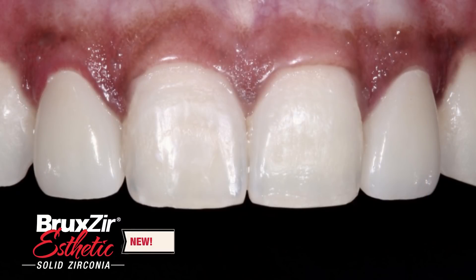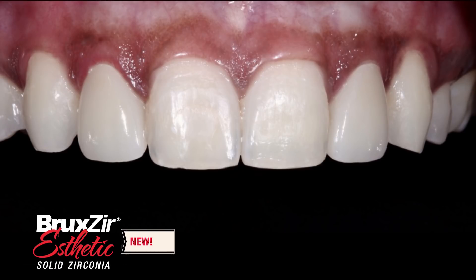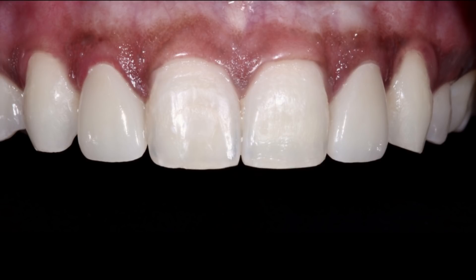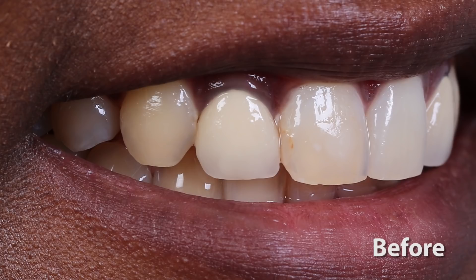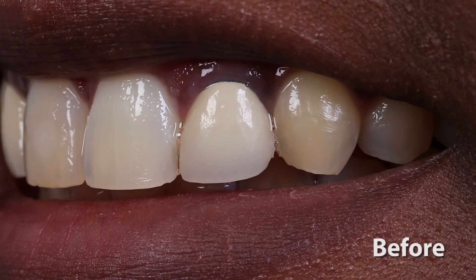Here's a look at the final restorations. I changed the crowns out for monolithic Bruxer restorations that blend in beautifully with the rest of her natural dentition. This unique zirconia formulation has been dialed in to be high strength at 900 megapascal of flexural strength with natural optical properties. This material is quite an amazing evolution since the more brawn-than-beauty Bruxer from 10 years ago, which was meant to be a posterior tooth-colored high-strength gold and PFM alternative. With the combination of high strength and translucency, Bruxer Aesthetic can be prescribed for any single unit or three-unit bridge in the anterior and posterior.